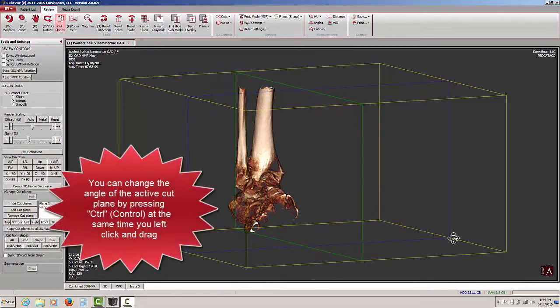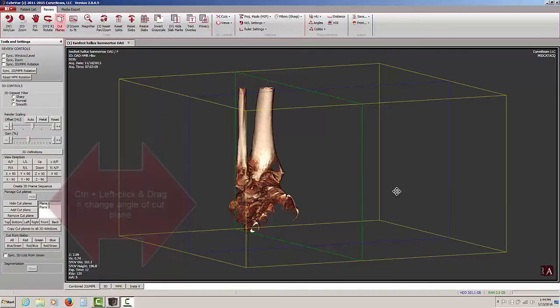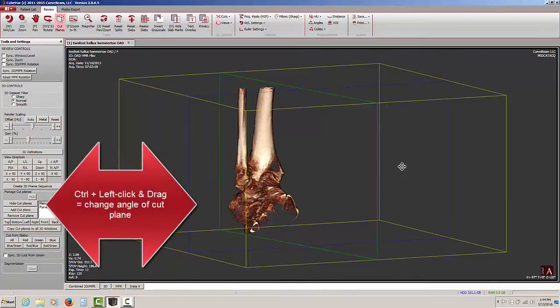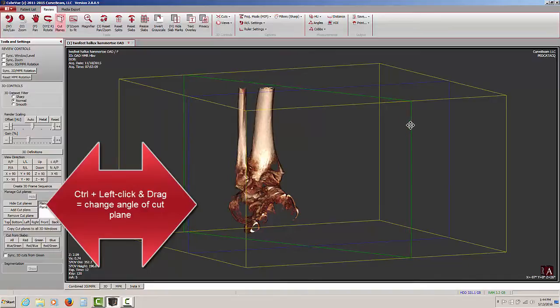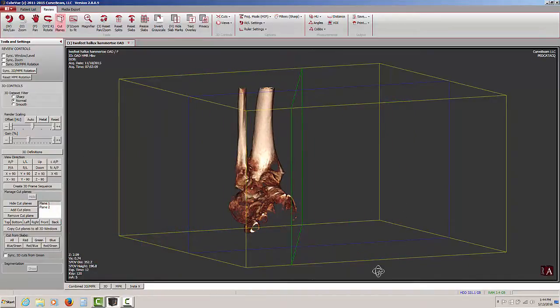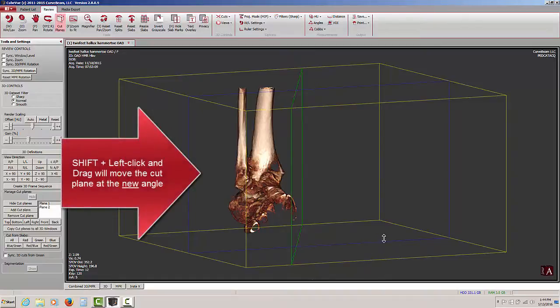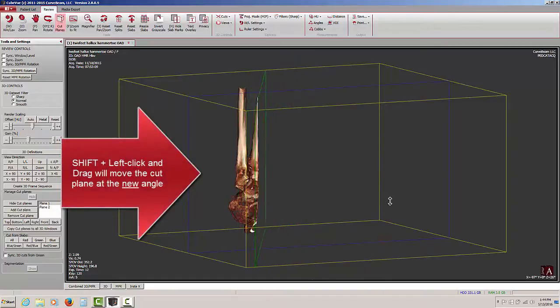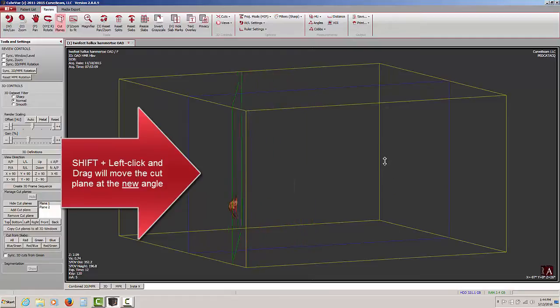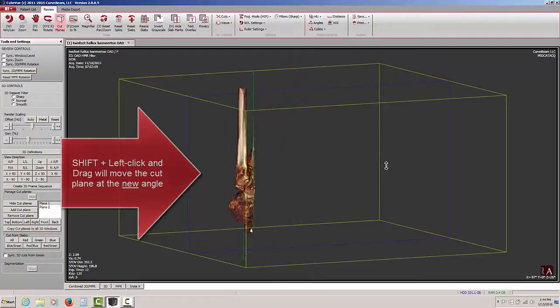I can also change the angle of orientation of the cut plane by pressing and holding the control key. When I hold the control key down and left click with my mouse, notice how the active or green cut plane is now changing angle. Once I do that, I'm going to let go of control, go to shift, and now I am cutting at an oblique angle as opposed to my original right angle.